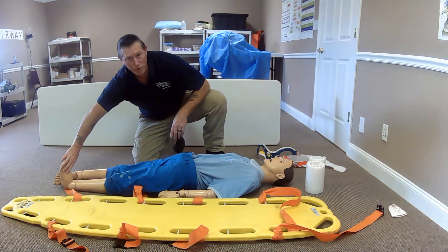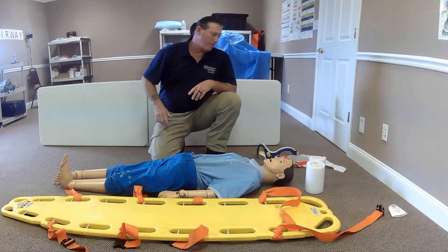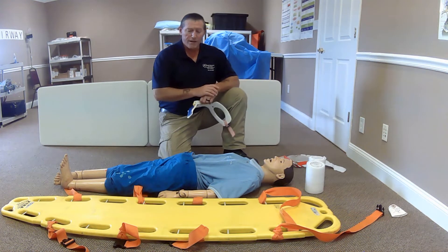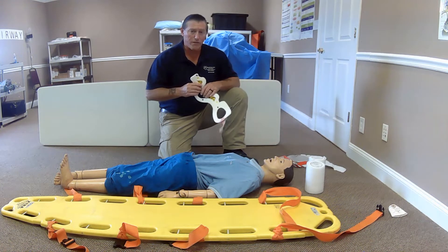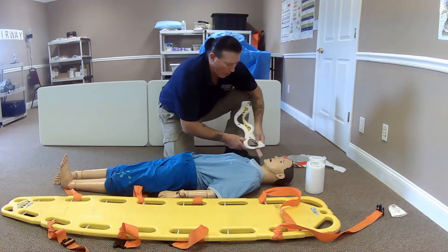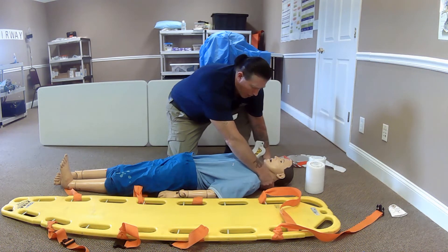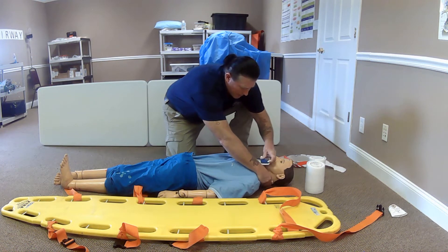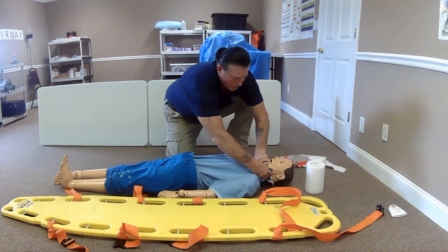Left side pedal pulses — present. Can you move your foot? Which toe am I touching? Now that I've confirmed good CMS in all four extremities, I'm going to apply the cervical collar. While my partner maintains C-spine stabilization, I'm going to slide the collar up underneath the back side of the neck, come around, and secure the collar.